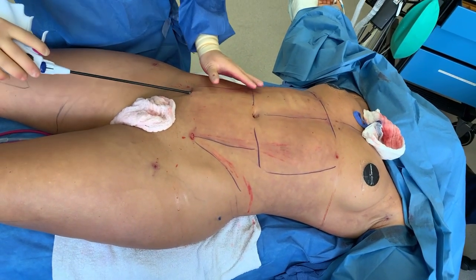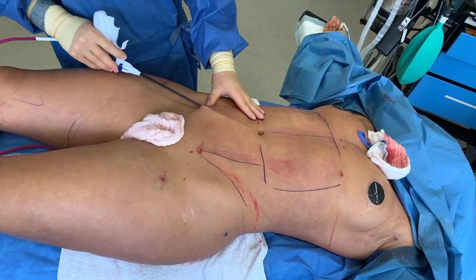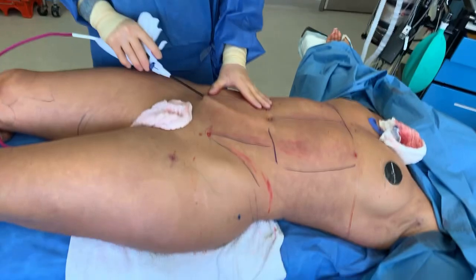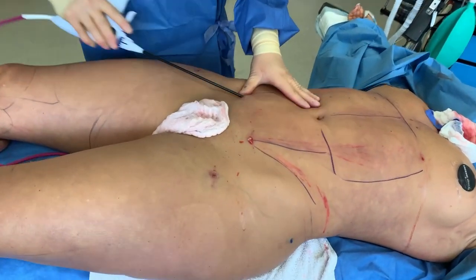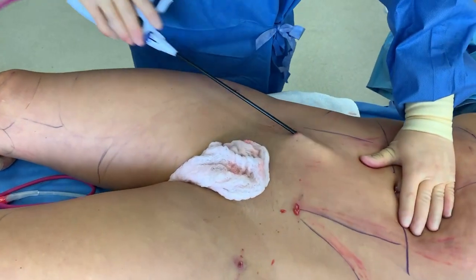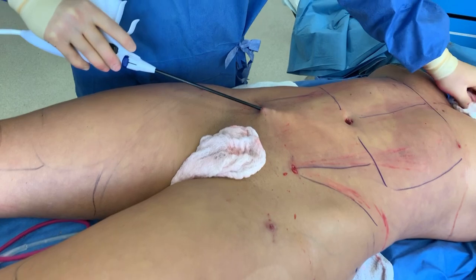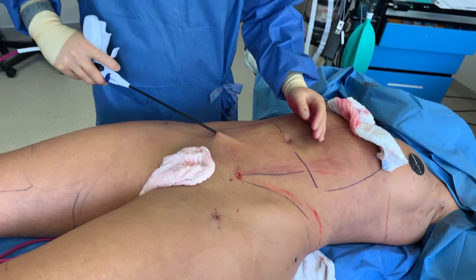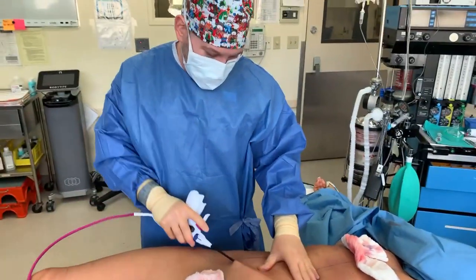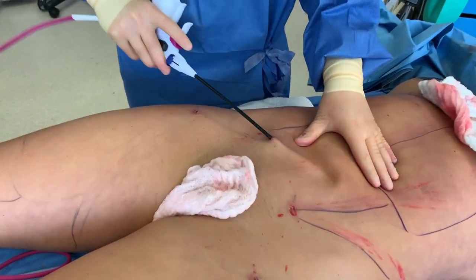Our goal for her is — she's very fit, she works out a lot, just some problem areas. So now she just wants to finesse. We call this supermodel lipo or finesse lipo. There's some scar tissue here breaking apart. Doing the lipo with the heating is now the gold standard — that gives the best result, much more than just the tumescent alone.